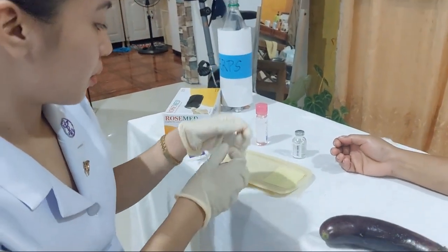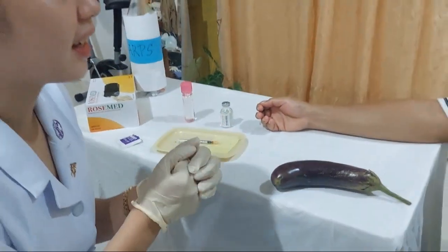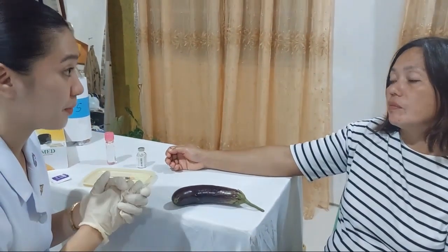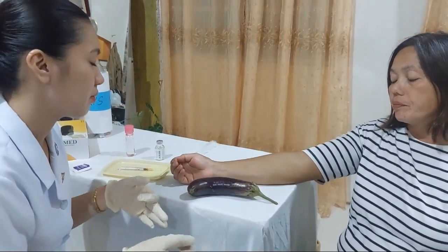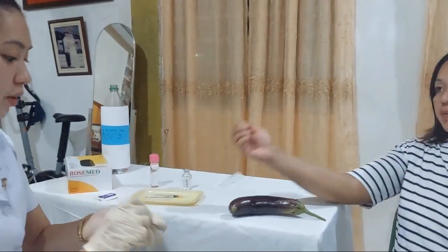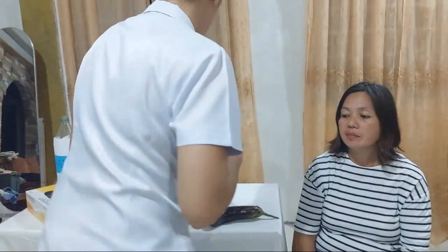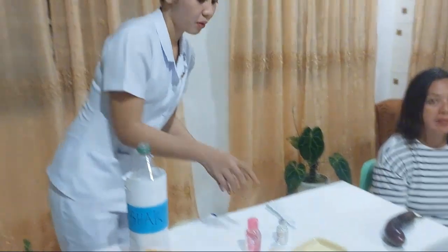Okay, so I'm just going to discard it, or place it here. Now that I'm done, don't massage the area, because it will disperse the medicine to other tissues. So don't massage the area. Okay, so now I'm going to discard my gloves in the proper receptacle, and I'm going to perform hand hygiene.